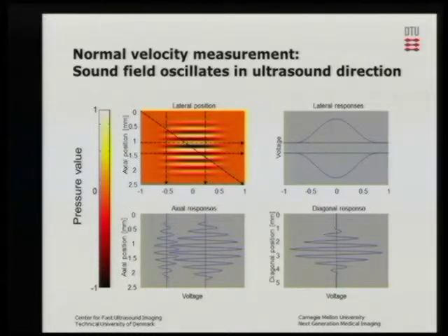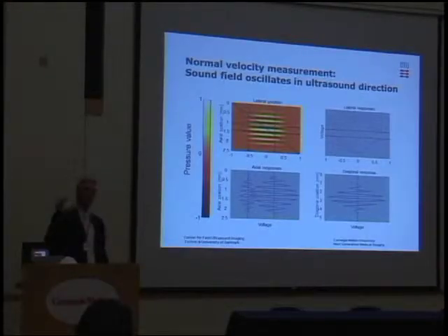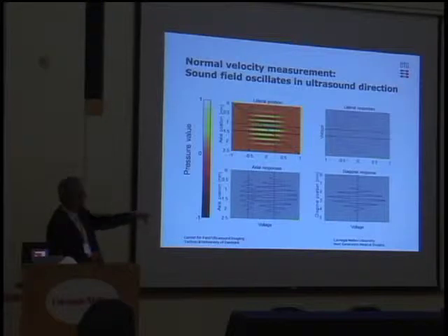So what we do in these systems is detect that frequency. But when we go across the field, we don't really get a frequency. If we go on the diagonal, it's okay, it's down in the corner. But when we go across, we have no frequency. That's why we don't detect anything.